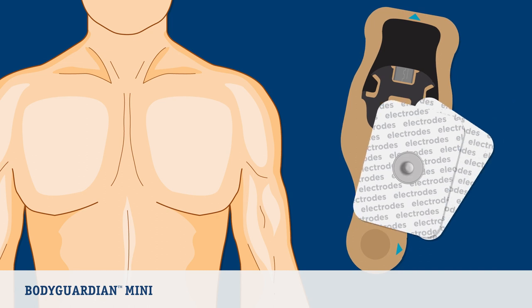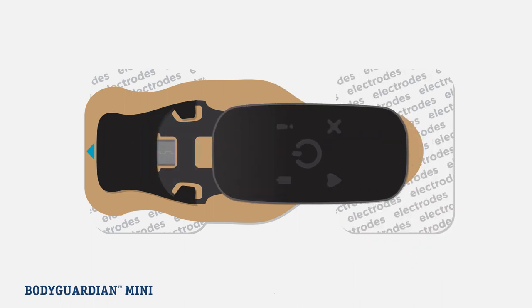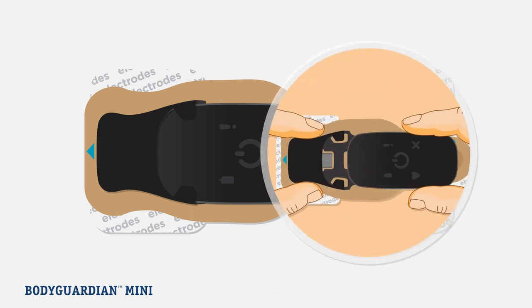Now that you have decided on a monitor placement and prepared your skin, let's snap the ECG electrodes to the bridge, then attach the monitor. Before inserting the monitor, you will need to firmly attach two electrodes to the top and bottom side of the bridge until you hear a snap. Next, slide the monitor into the black molding on the bridge until the micro USB connector on the bridge is inserted completely into the monitor. This is most easily accomplished on a flat surface, like a table. To line up the micro USB connector with the port on the monitor, you will need to wiggle the monitor slightly to align. To ensure a good connection, pinch together with thumb and index finger.